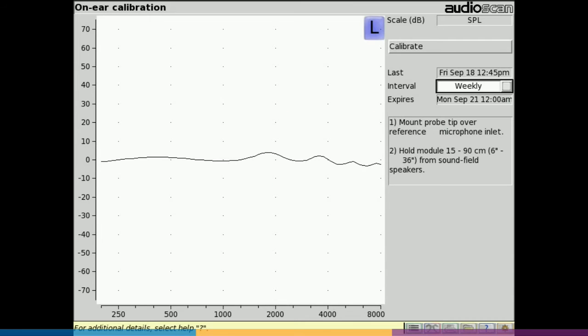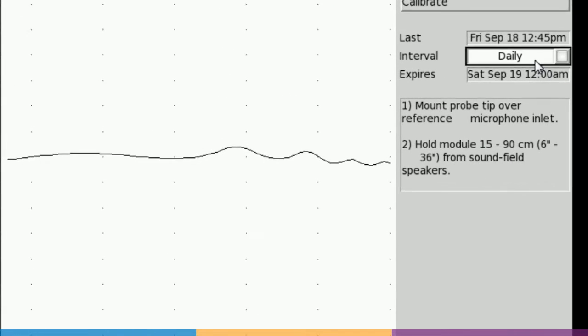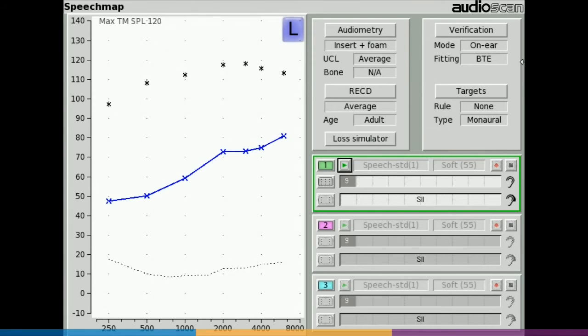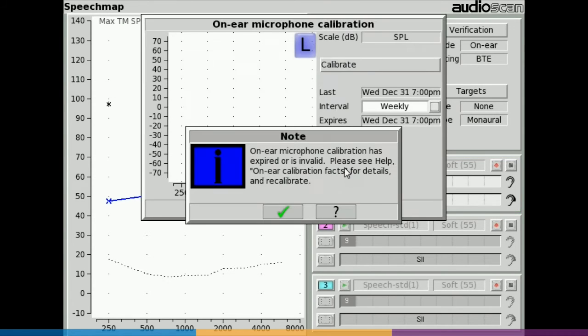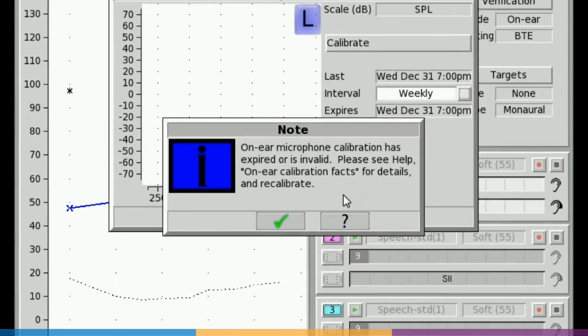Calibration can be performed as often as desired but will expire at 12 a.m. the following day or 12 a.m. the following Monday, depending on the choice of daily or weekly calibration interval. After the calibration has expired, you'll be prompted to calibrate whenever you attempt a test that uses the on-ear measurement microphones.